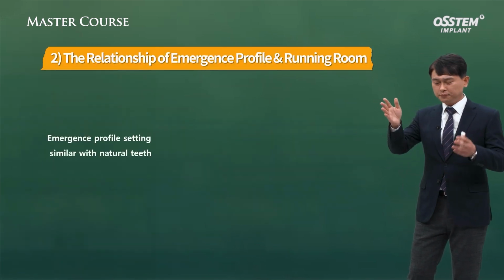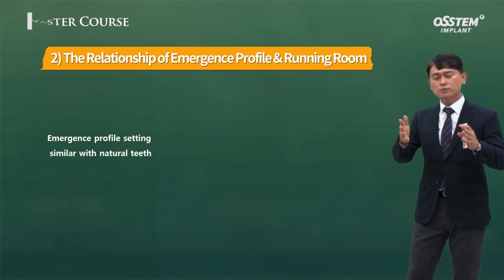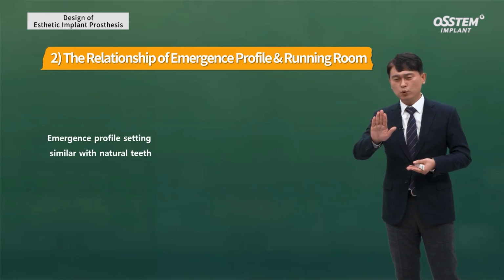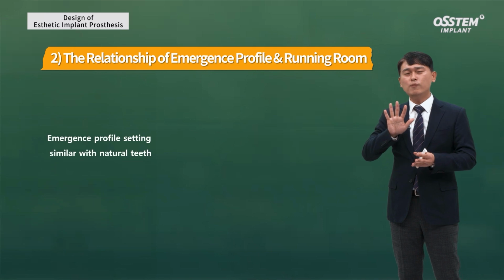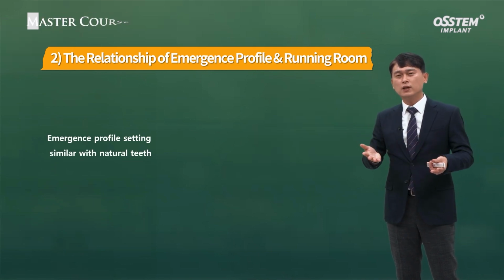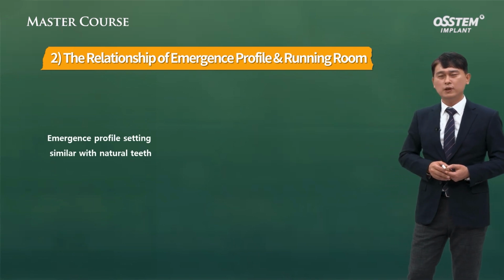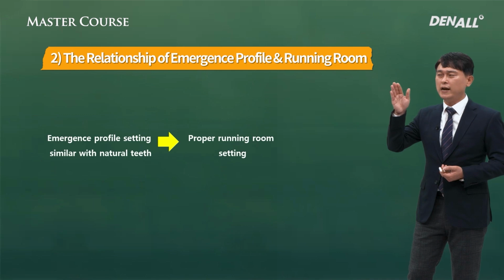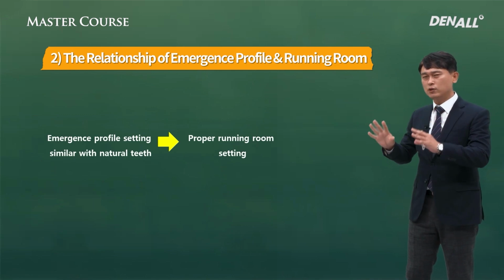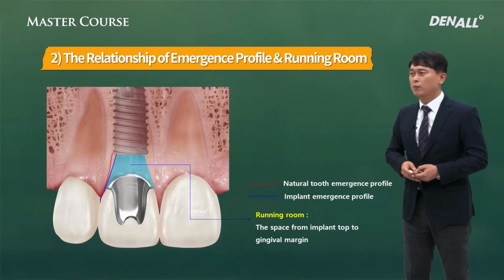When you make an emergence profile, if you're too much focused on that and subgingiva abutment shape is not considered and running room is not considered, it will be shrunk, and if you press it too hard, the emergence profile can collapse. That's why running room is important. We need to set emergence profile appropriately, and proper running room needs to be set, followed by prosthesis.